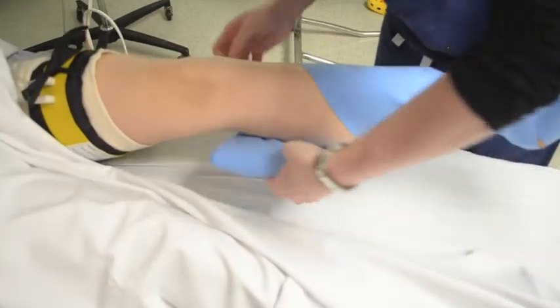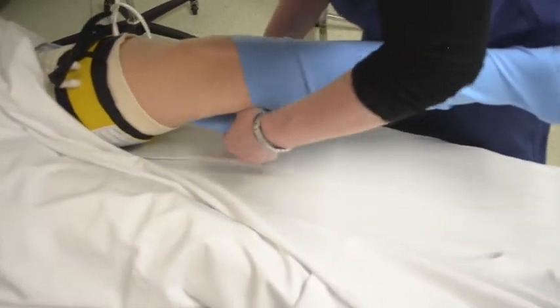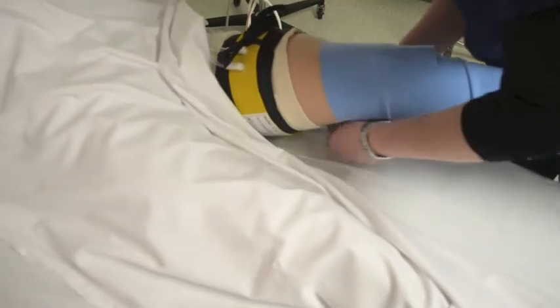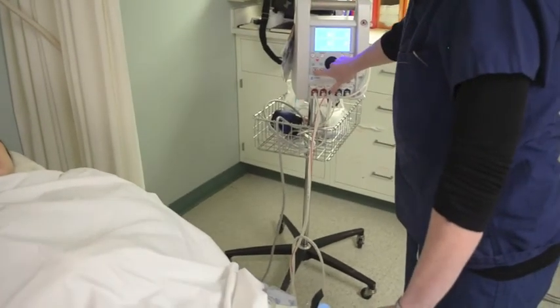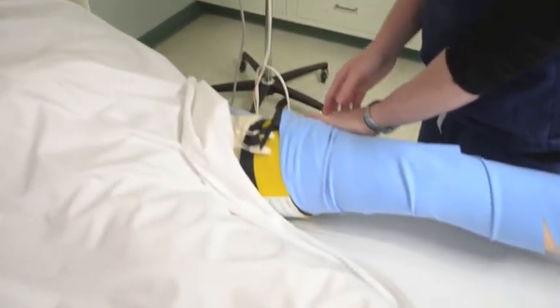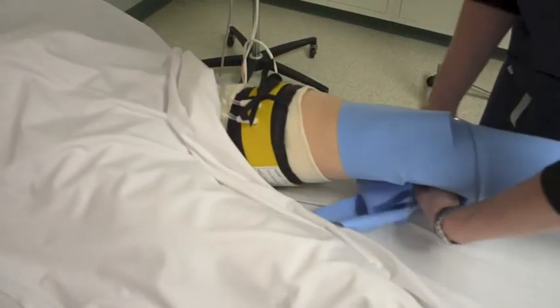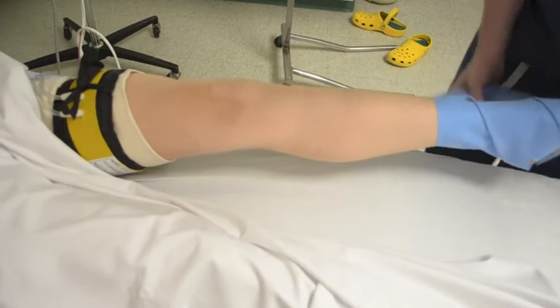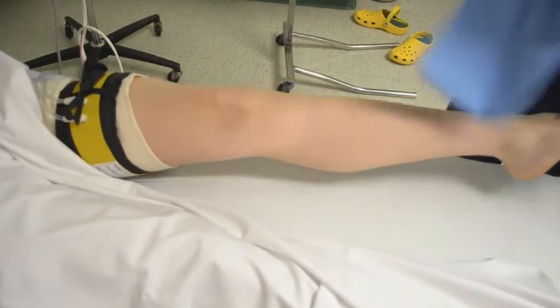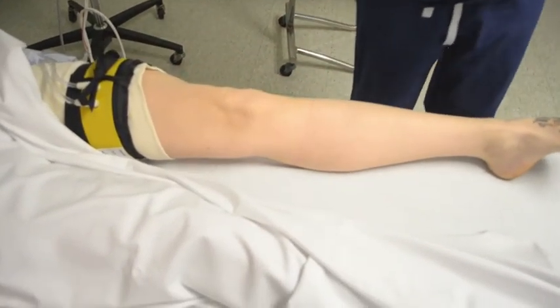Once the Esmarch covers the entire extremity, removing all the blood from the leg, the inflation cuff is then inflated, and then the Esmarch is removed. This allows all the blood to escape from the extremity, giving us a bloodless field.